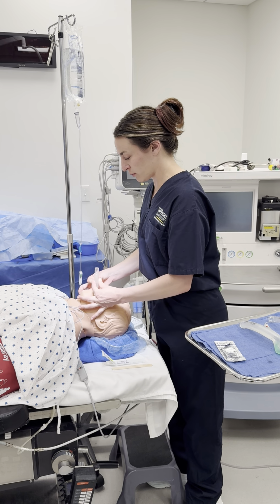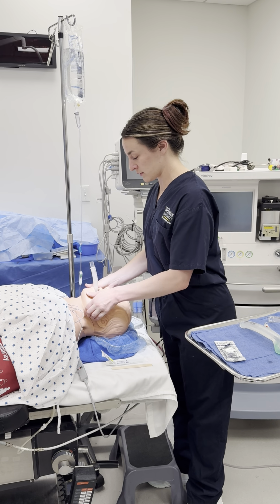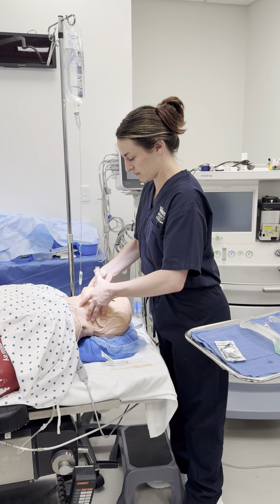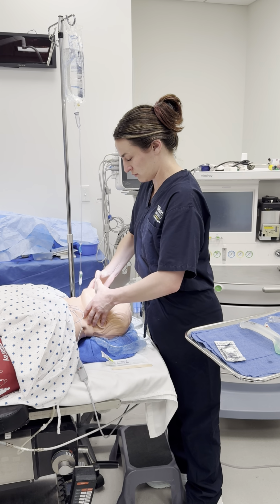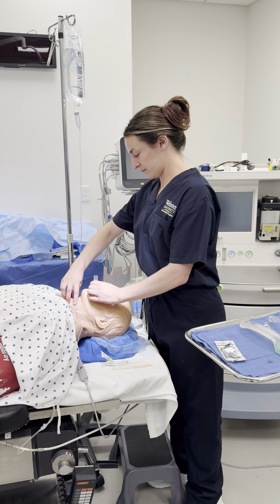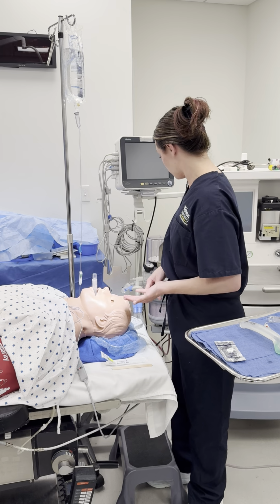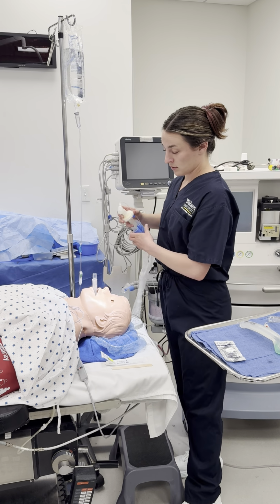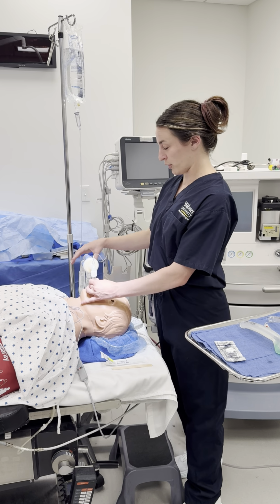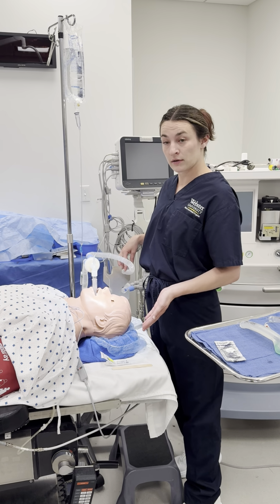One thing I like to do when placing my LMAs is to get behind the mandible and jaw lift like this while pushing down on the LMA to fully seat. Just like that. Now that the LMA is in place, the patient can breathe on their own. We're going to hook up our airway circuit so that we can give them oxygen while they're breathing spontaneously. We can also deliver anesthetic gases through here.